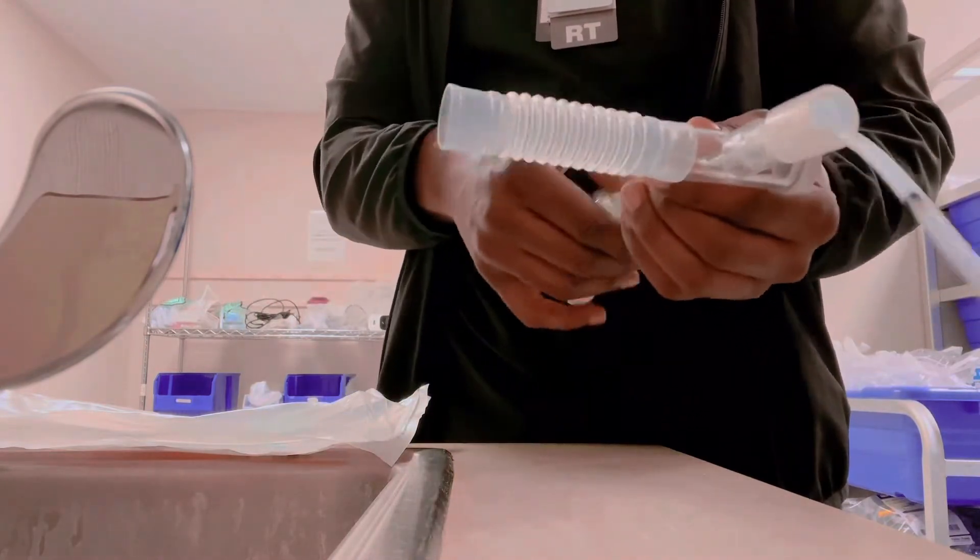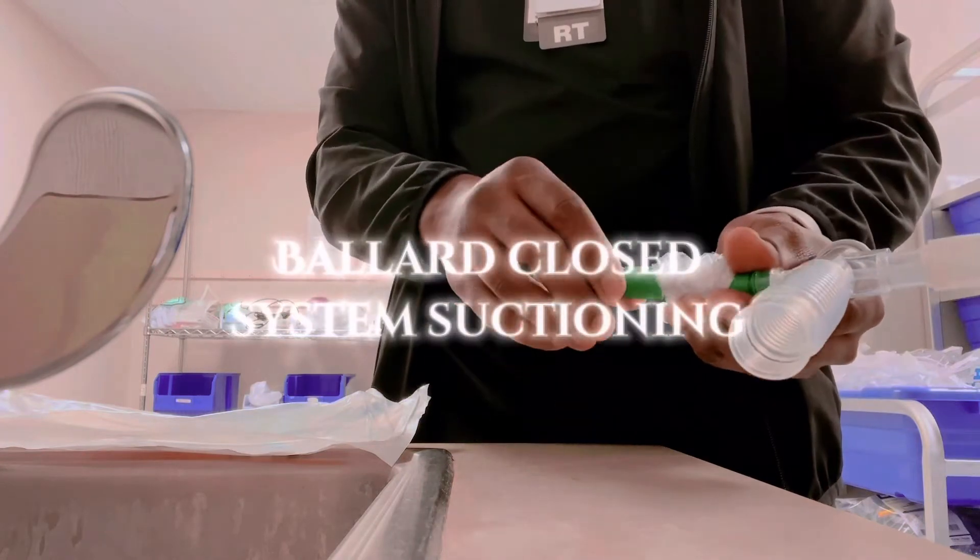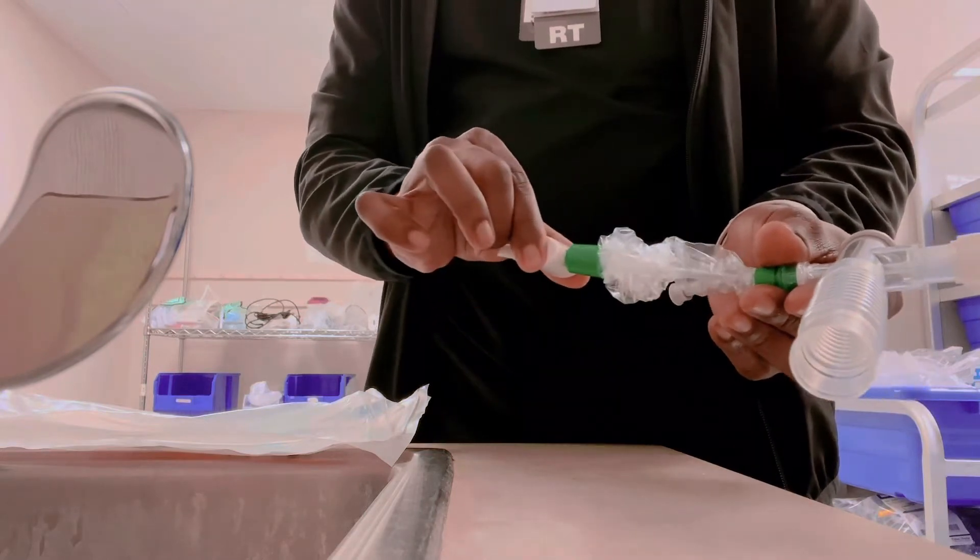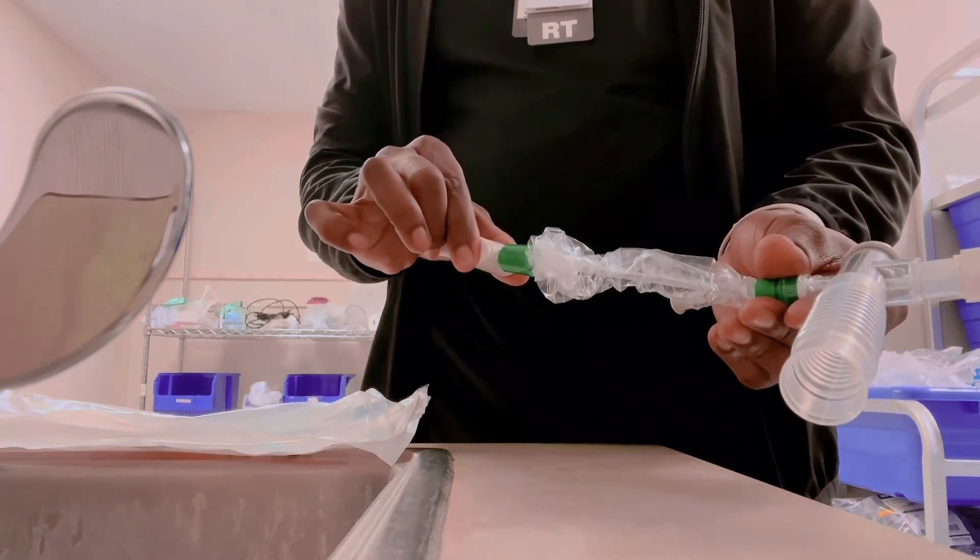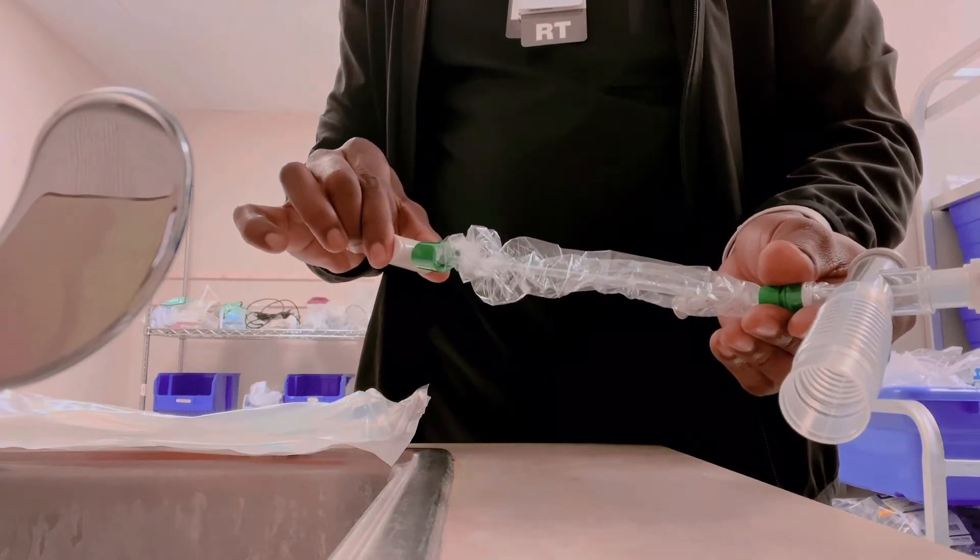Advance the catheter until you meet some resistance or get down to the carina. Press the button while slowly withdrawing it through the patient's airway, through the trachea.